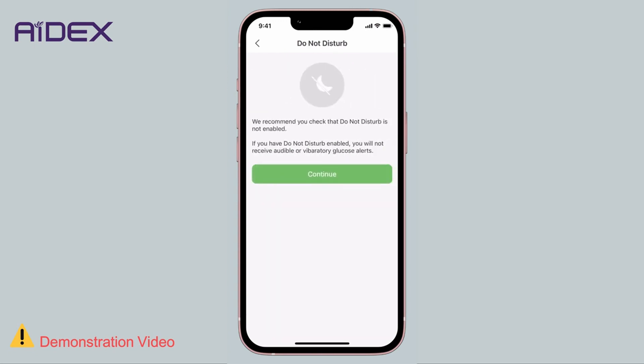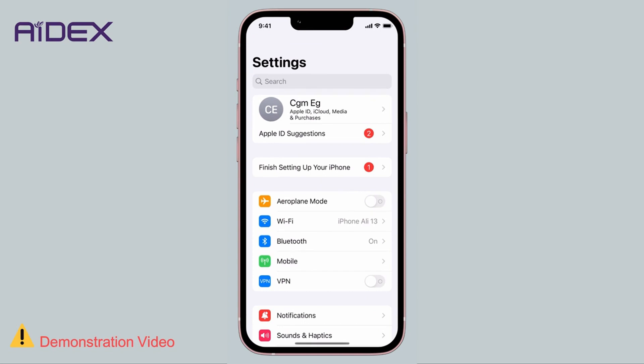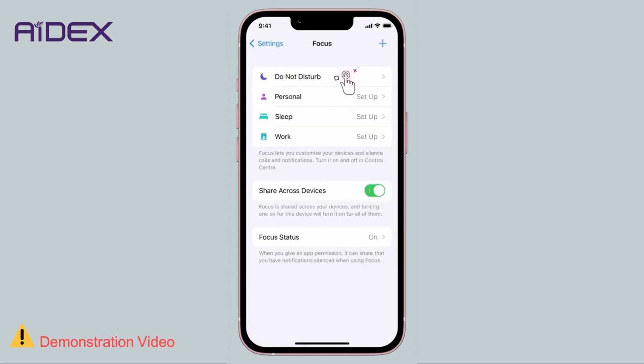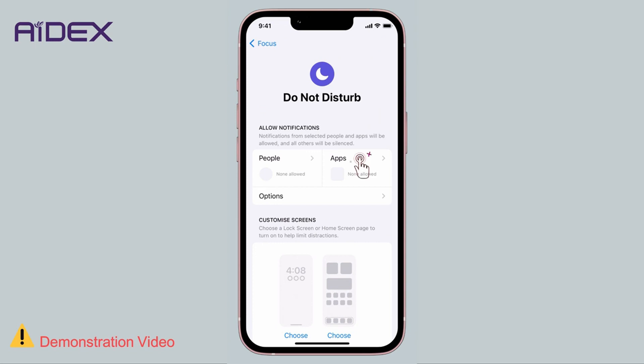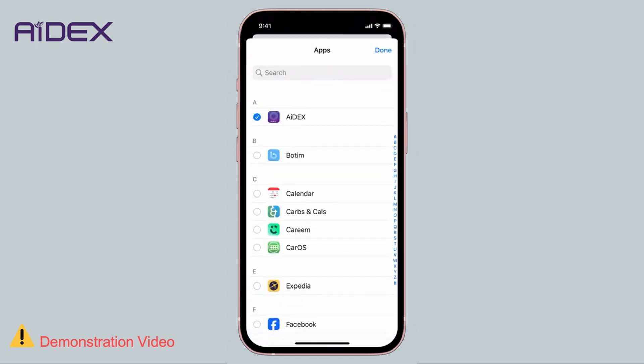Ensure that the application is allowed to function in Do Not Disturb mode. To enable it, access your mobile settings, select Focus, then Do Not Disturb, then Apps, and add the 8X app to the list of allowed apps.